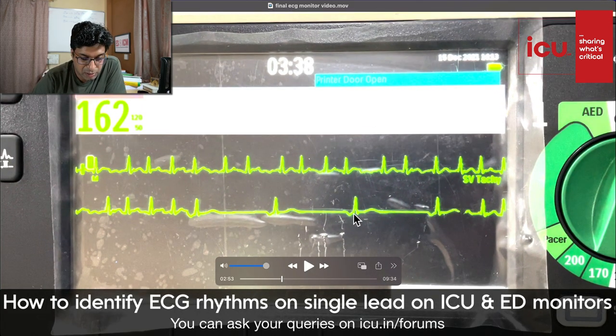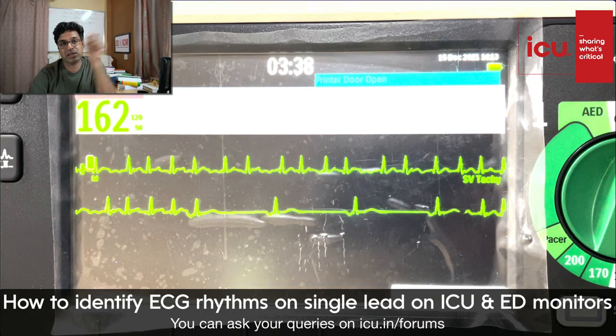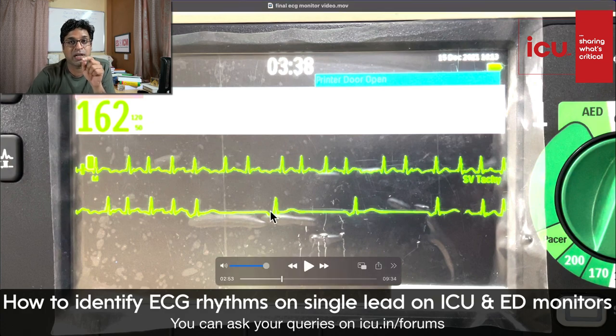Okay. So you see, now there is a rhythm in which there is a P wave, but it is inverted. From atria to AV node to ventricle, this direction, it will be a positive P wave. But if it is from the junctional area, around the AV node, the P wave direction goes upside. From junctional it originates and goes upside, so it will be negative. So it's a junctional rhythm.